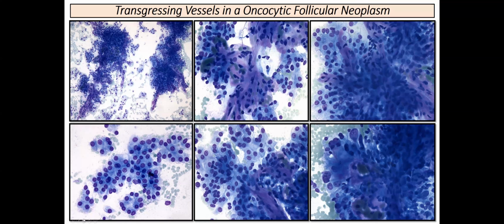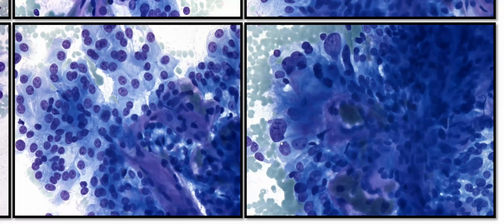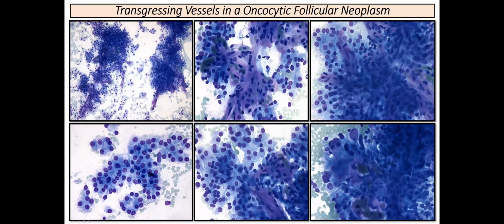One thing to notice is that it is very common for oncocytic cells to have random nuclear enlargement. You cannot use that atypical feature to call something neoplasm or malignant because this is inherent to oncocytic lesions. They can also form smaller follicular structures or even papillary groups.